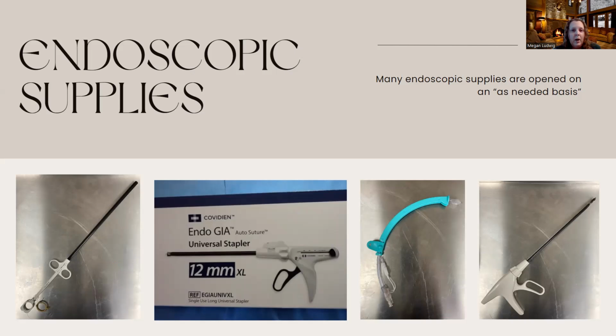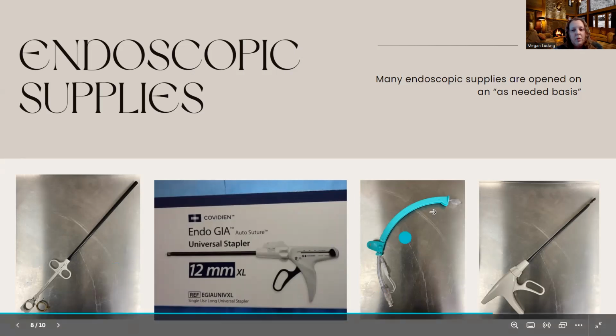So if we need to see behind or rotate the uterus from side to side during a scope case, they're going to want something like this in place.